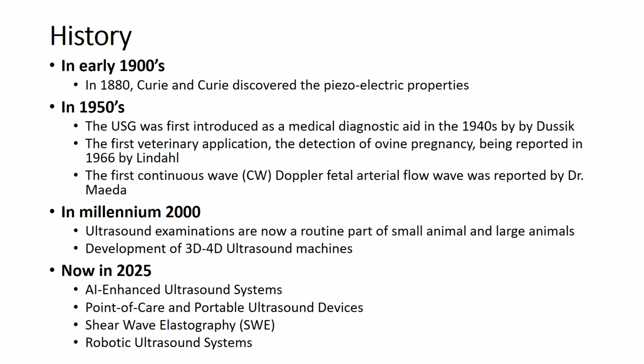In 1880, Curie worked on the piezoelectric crystal, which produces sound, and that energy is converted to electrical energy. Afterward, progress continued in ultrasonography.